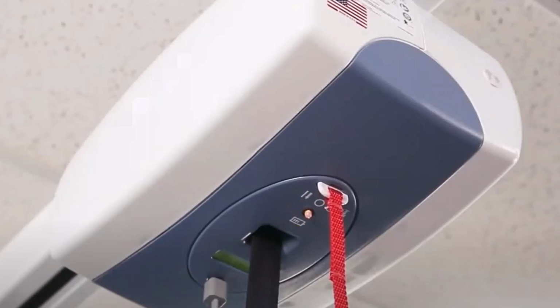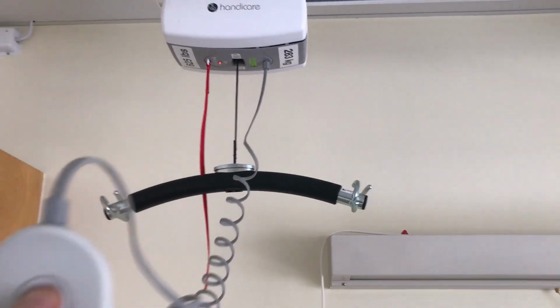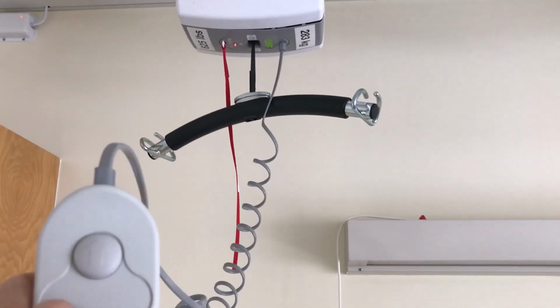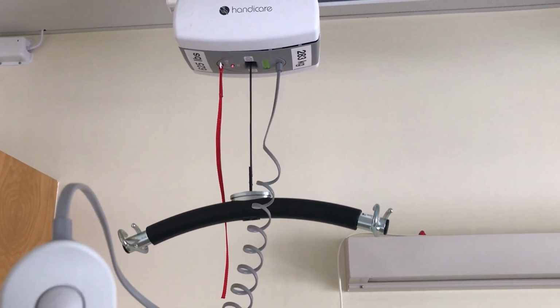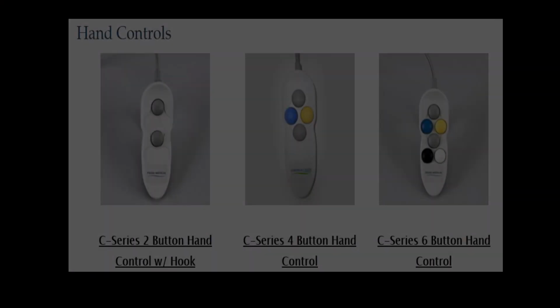These motors have a pneumatic hand control which uses air pressure and is not electric. To raise or lower the carry bar, or in the case of power transverse motor models, they have 2 or 4 colored buttons to move the motor in particular directions on the tracking.